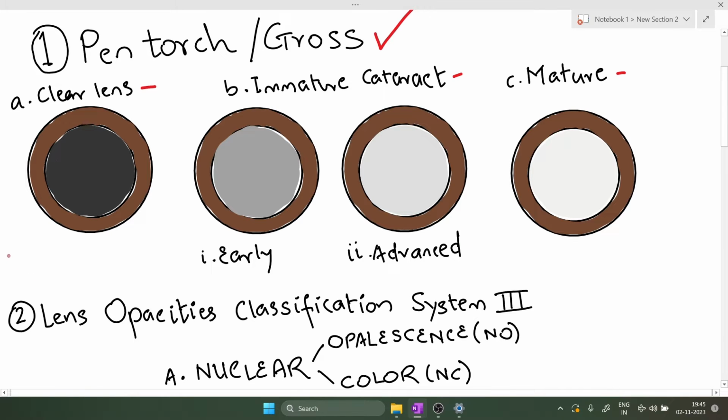Why not black? Black indicates that the pupillary space is completely empty or it is filled with a very transparent structure. The lens is not 100% transparent. It absorbs some of the light and hence appears a dark gray in color. If you see a black reflex, it either means there is aphakia, which could either be post-surgical, post-traumatic, for whatever reason, or it means there is an IOL, a pseudophakia.